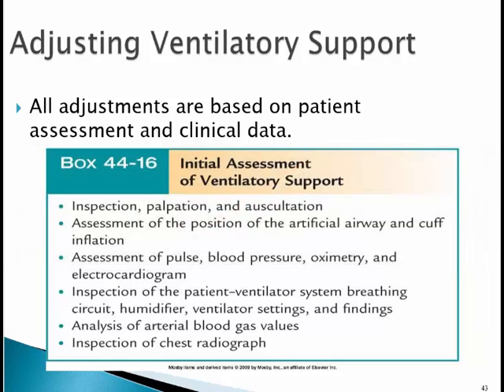So now inspection, palpation, and auscultation. Let's look at them and let's see what's going on there. The assessment of the position of the artificial airway and cuff inflation. Assessment of the pulse, blood pressure, oximetry, and electrocardiogram. Inspection of the patient-ventilator system, breathing circuit, humidifier, ventilator settings, and findings. Analysis of the arterial blood gas values, and then inspection of the chest x-ray.